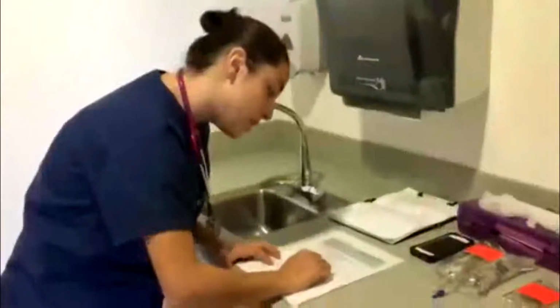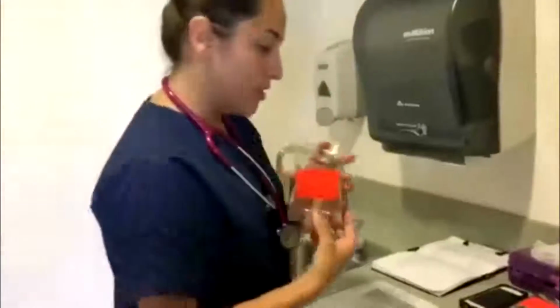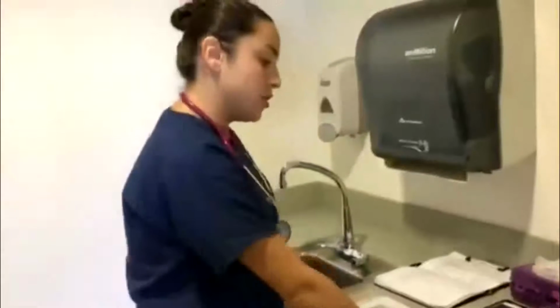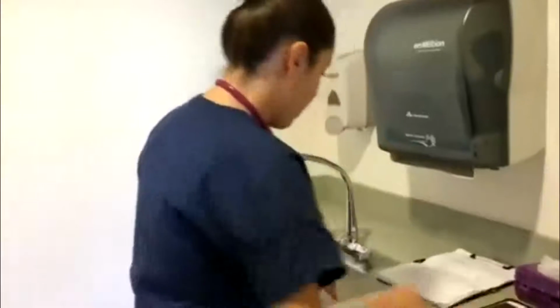So 100 milliliters divided by 4 hours is 25 milliliters per hour. So I'll be administering 25 milliliters per hour of Zosyn to my patient. And for my normal saline, the doctor ordered to administer this at 75 milliliters per hour, which is my primary fluid, and my Zosyn is my piggyback, which is my secondary fluid.